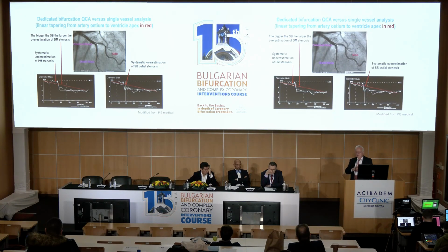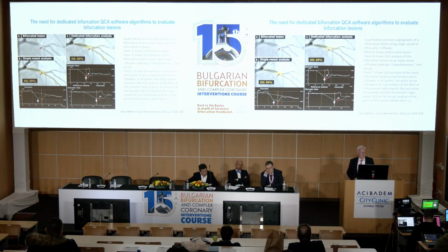Sometimes the curve is a bit descending because we are not taking into account very small vessels, but they are there. And now we propose for the 3 segments of a bifurcation a diameter, and also a true degree of stenosis. Again, this is the curve proposed by Alexandra Lansky.